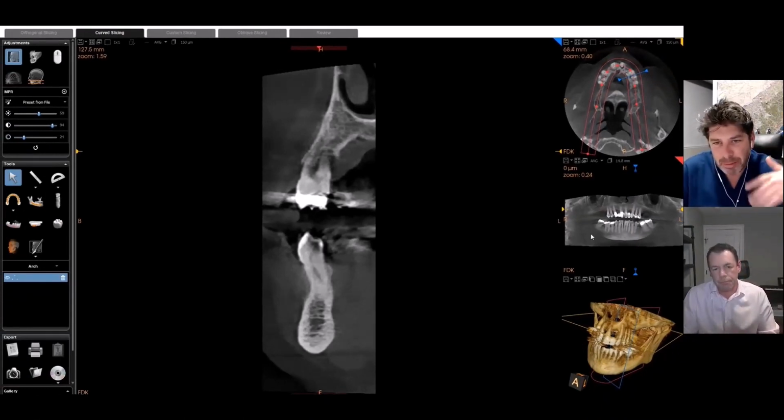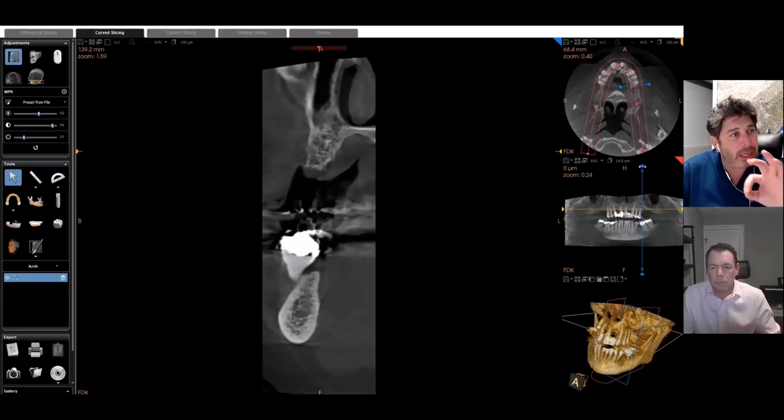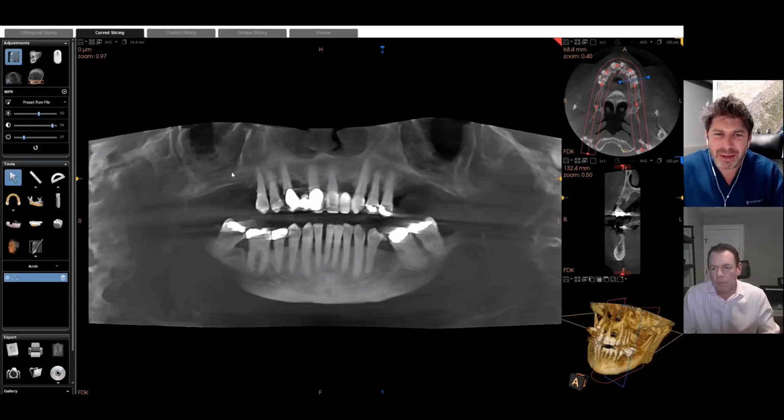Kind of what people talk about is 12 to 15 millimeters of clearance, so that you can have the substructure and the actual end prosthesis. So patient's got decent quality bone, but not a lot of it. So we plan to do an All-on-X case, or a Smile in a Box, or a Pro Arch.